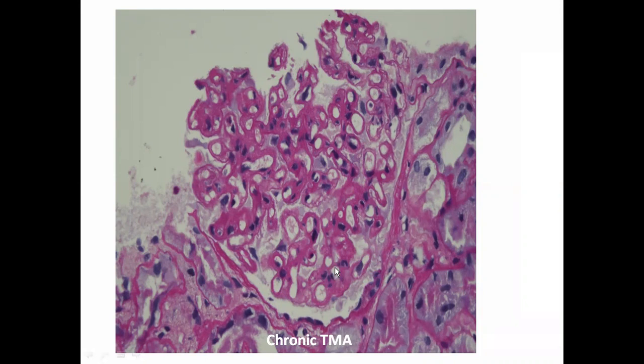And how to differentiate TG from chronic TMA? Here we are dealing with a native kidney biopsy, but I'll tell you how to differentiate, because I'll tell you one important thing. Transplant glomerulopathy by definition means there is thickening, non-uniform thickening and duplication of the glomerular capillary wall, full stop. Transplant glomerulopathy is not synonymous with chronic antibody-mediated rejection. First, the foremost important point.